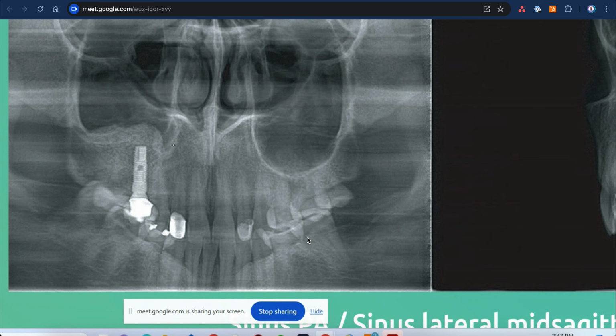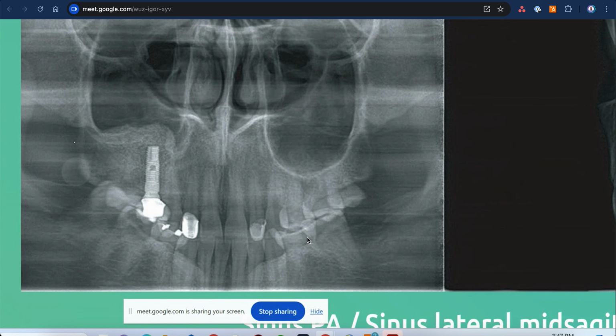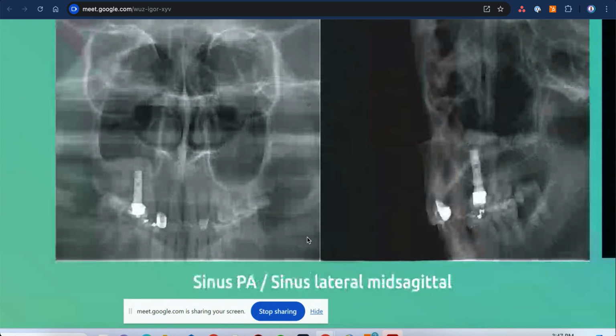So by doing this kind of X-ray, we have ensured that the sinus lifting is correct and the implant position is secure and there is no harm. Okay. Thank you for that. That's really very useful.